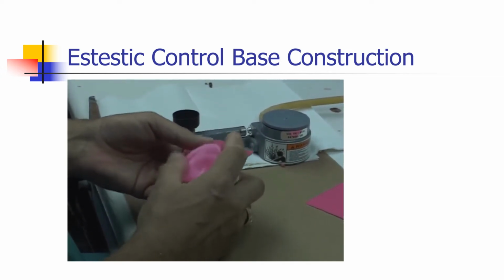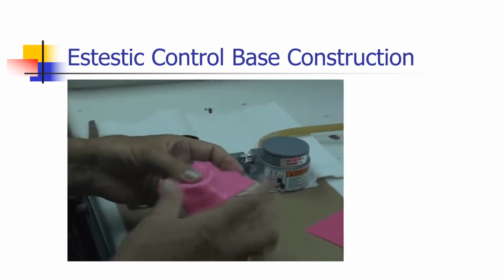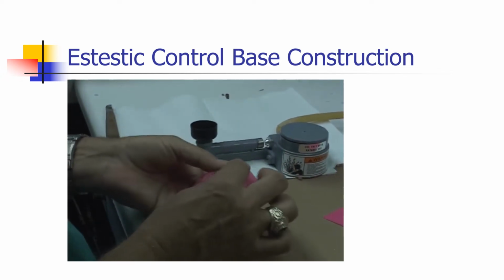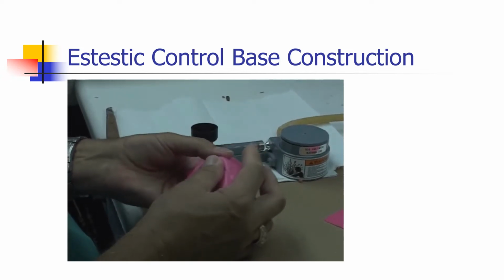This can be used for full dentures as well, this technique. This was developed for full dentures, and I've modified it. This technique is the old Swissadent technique for overdentures.